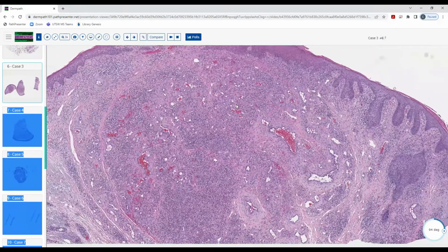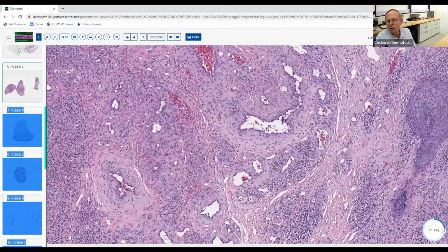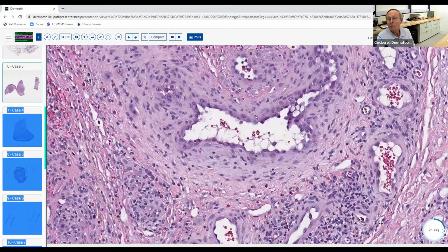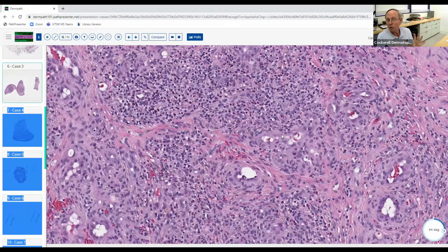Is that trying to form a granuloma, like because of infection or something? Well, I think it is a vascular lesion, so we're on the right track there. But what kind of inflammatory cells do you usually see, say, for example, in Kaposi sarcoma? And usually also in KS, you don't get these really thick wall blood vessels. You get these slit-like vascular spaces, and they don't really have the really prominent endothelial cells protruding in the lumen. So they're usually very more spindle cell as opposed to these almost epithelioid endothelial cells here. And if you do get inflammatory infiltrate in KS, it's usually plasma cells. So you don't usually see EOs like this.